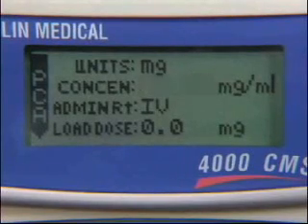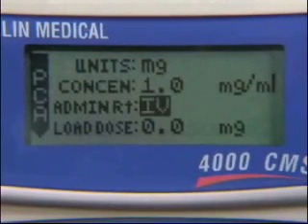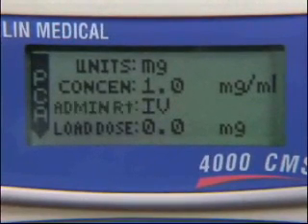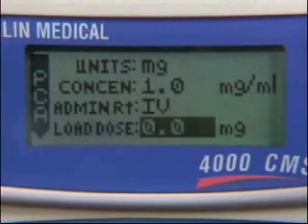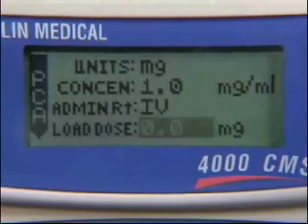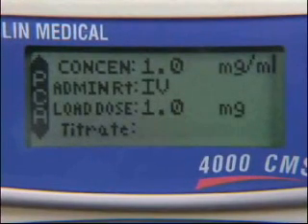Enter the desired concentration and press the Yes Enter button to advance. If ML was selected, the concentration line will not be present. The administration route choices are IV, epidural, or SQ. If you need to change the administration route, press the No Change button until the desired route is showing, then press the Yes Enter button to confirm and advance. A loading dose is a one-time bolus given at the beginning of the infusion by a clinician. If a loading dose is required, enter the amount using the number keys and press Yes Enter. If a loading dose is not required, press the Yes Enter button to confirm the zero.